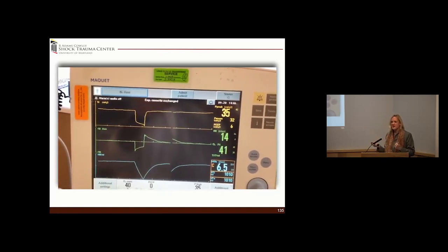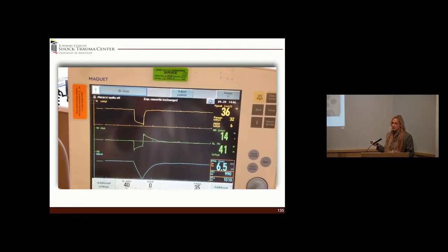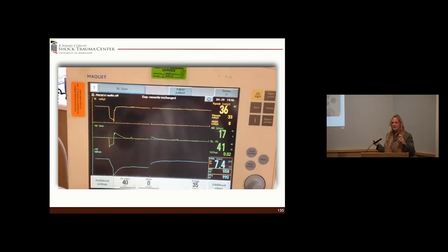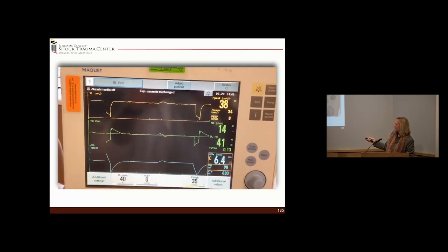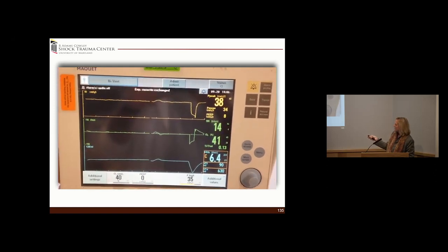This happens a lot of times if there's a leak, if the patient makes an effort, if there are secretions, anything that mimics a breath, a spontaneous breath. So it tries to synchronize and kicks out. So now it's back to its normal for a couple of breaths, and now watch, here comes, look at my volumes, and watch, here comes, there we go.